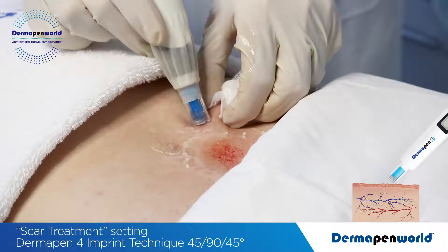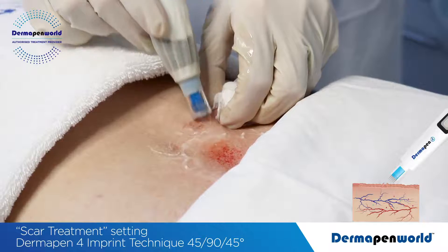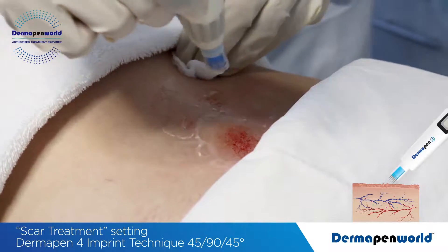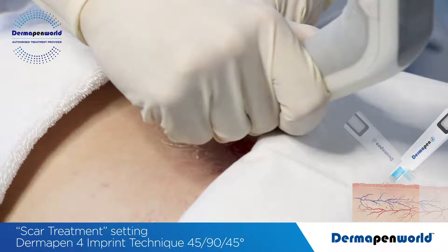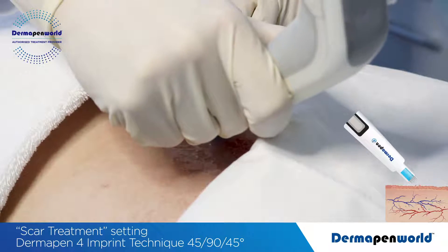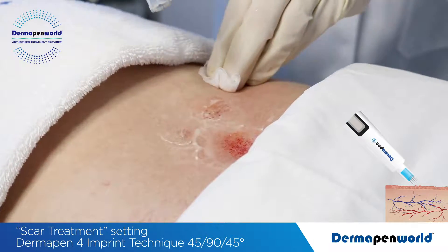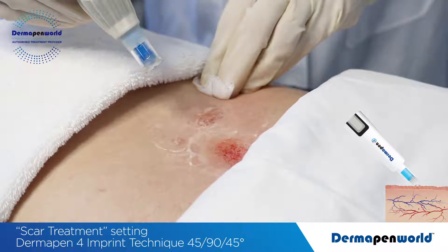Now support the tissue and go in at a multiple angle, again holding 3-4 seconds per application. Simply adjust position of your pen and your gauze, watching and ensuring that your fingertips do not risk needle stick injury.